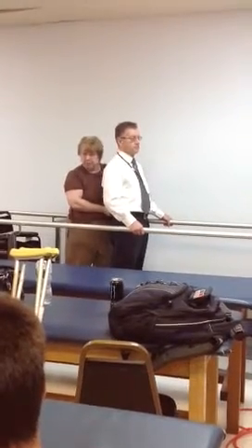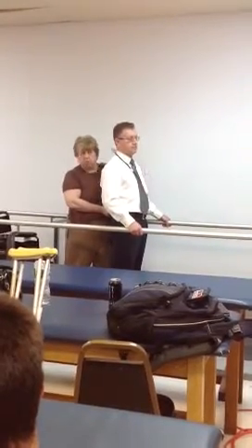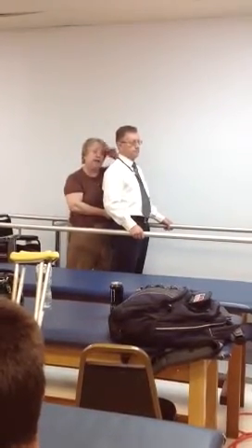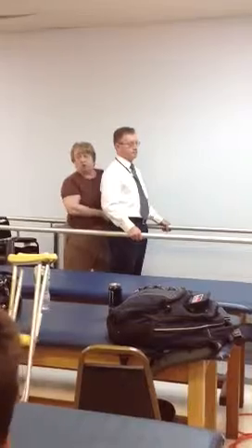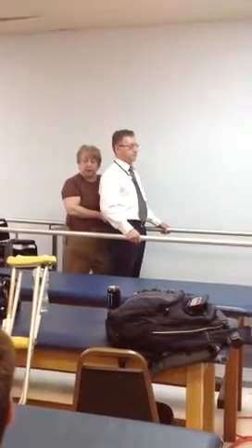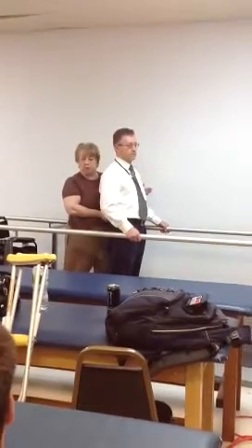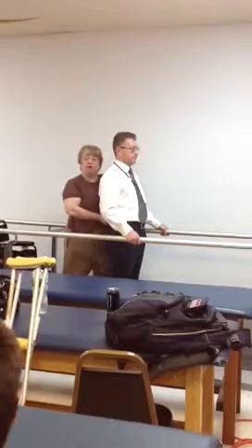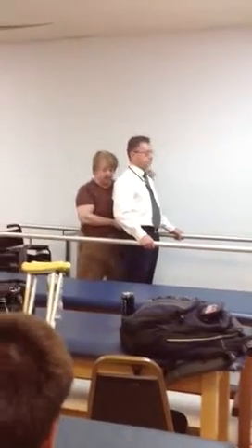So then you can go through all of the exercises that we did in the parallel bars, and those are listed for you. Most of the exercises are listed for you in the handout. And then you're gonna go right into a drag-to gait. So you've talked to him about what the drag-to gait is. So we've done all of the pre-gait activities.